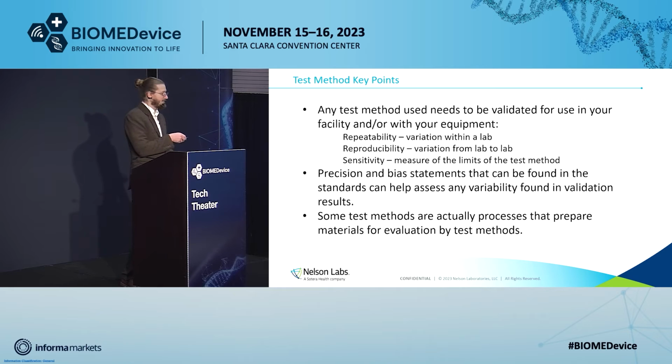And some of the test methods aren't actually going to give you meaningful data. These are your tests like distribution or aging. It's just an exposure to certain conditions, right? If you run a shelf life test, if you age something, congratulations, it's aged. But does it pass, right? That's when you need your integrity, microbial barrier, and strength tests to demonstrate that your sterile barrier system is still functional, adequate, appropriate.